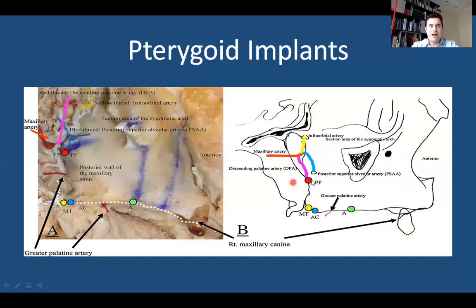Now I'm showing with my mouse the edges of the pterygopalatine fossa. Here, PF is the most cranial point of the pterygomaxillary joint, and here is the most caudal point of the pterygomaxillary joint. The distance between these two points is the pterygomaxillary column, and it is estimated to be 13.5 millimeters. It is very important to identify this landmark in the CBCT and evaluate this distance before the surgery. All these operations are preoperative evaluations.